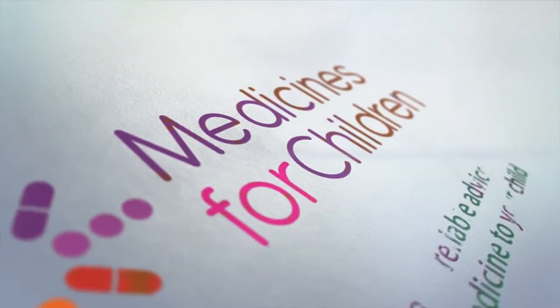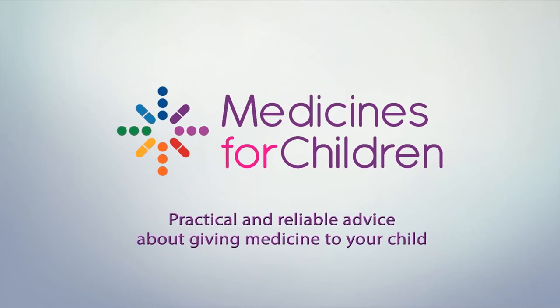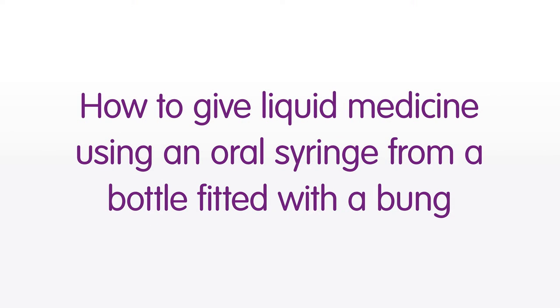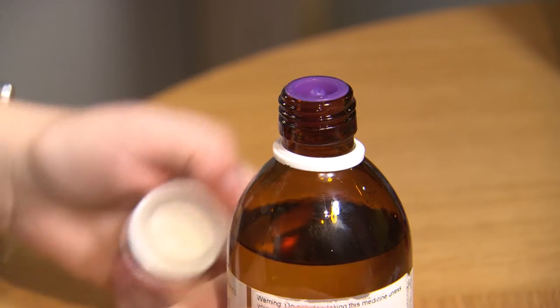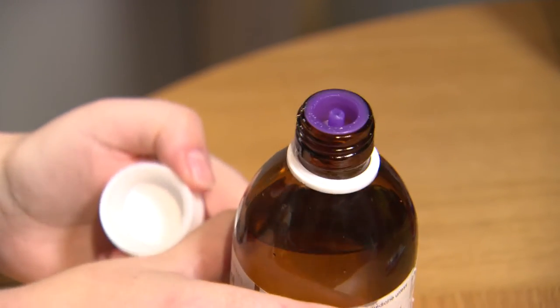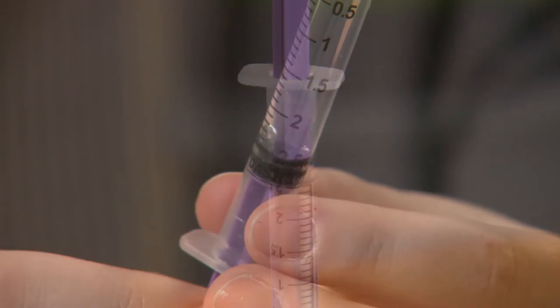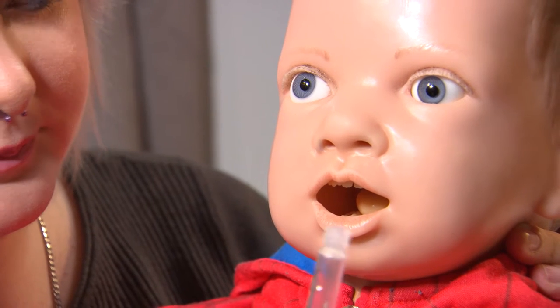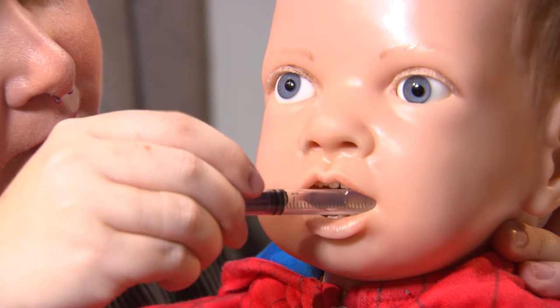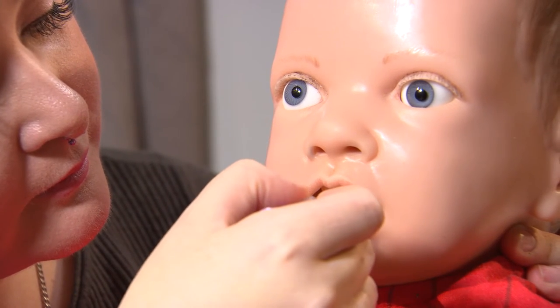Medicines for Children — practical and reliable advice about giving medicine to your child. How to give liquid medicine using an oral syringe from a bottle fitted with a bung. Liquid medicines are probably the most common type of medicine you will give to your child. It is very important that you are able to measure out the correct amount of medicine to give to your child. This film will show you how to give a liquid medicine to your child using an oral syringe and a medicines bottle fitted with a rubber bung. You should watch the film all the way through to the end before giving medicine for the first time.